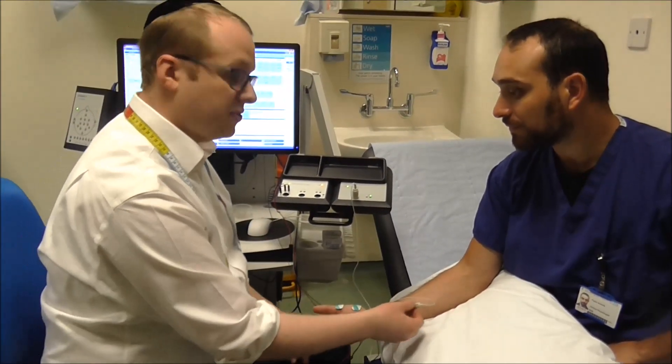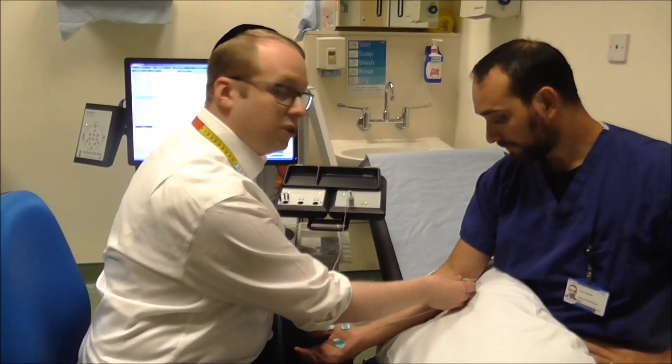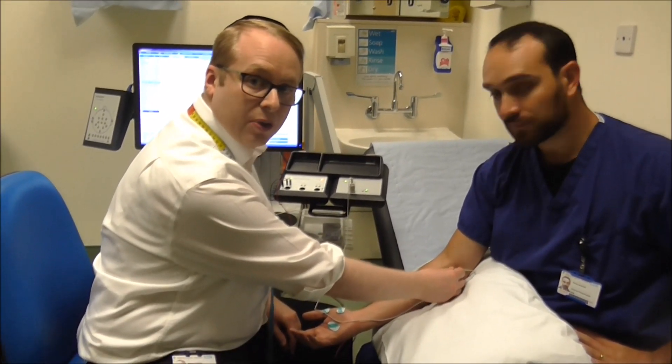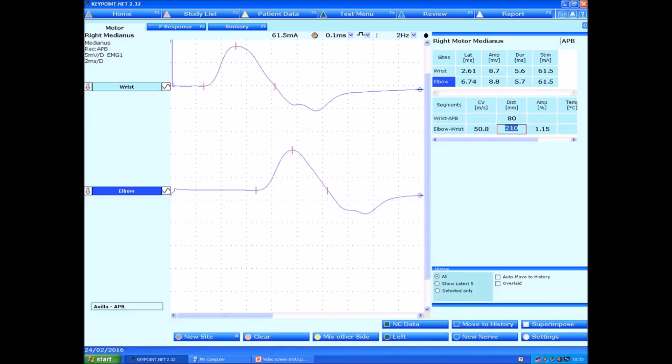I'm now going to test the nerve a little bit higher up at another point, and ensure that the conduction is working okay between the elbow and the wrist. So we can see the conduction between the elbow and the wrist — I simply measure the distance, and that's conducting at 50 metres a second.